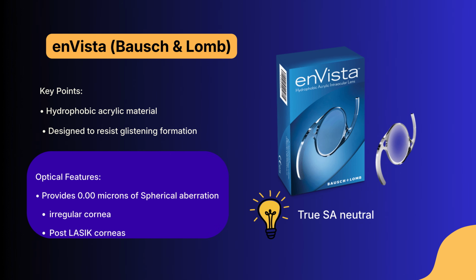Then we have Envista. Envista is basically a true aberration neutral IOL, meaning it has zero spherical aberration. It basically preserves the patient's natural corneal profile, making it especially useful in post-LASIK or irregular corneas, where the corneal aberration is unpredictable and you do not really want to meddle with it. So it's a very safe option for irregular corneas.